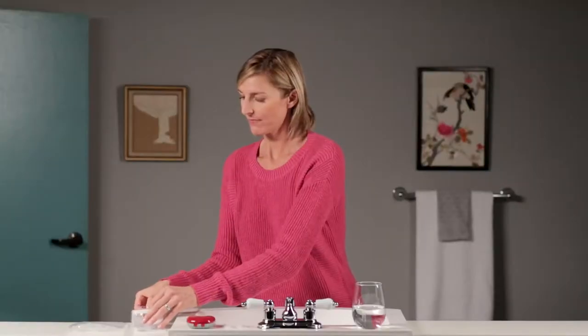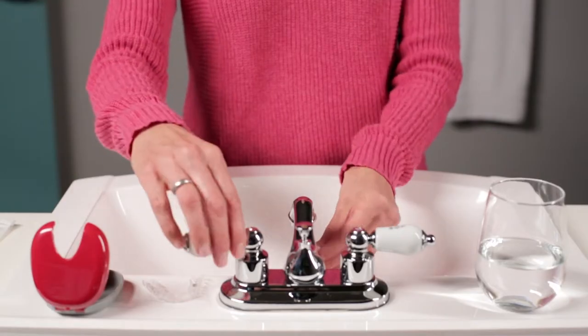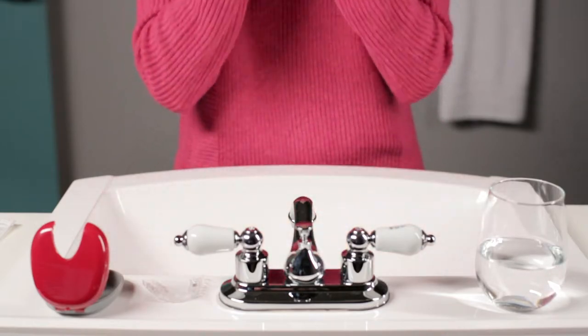Let your doctor know if you have difficulty removing your aligners. When starting a new set of aligners, switch to your new set in the evening. Rinse the new aligners and wear them for at least 12 hours straight.